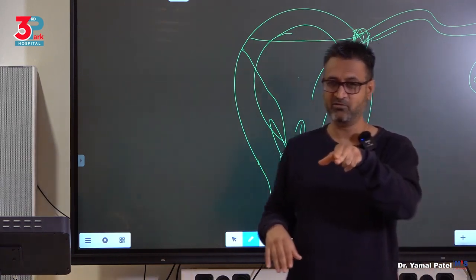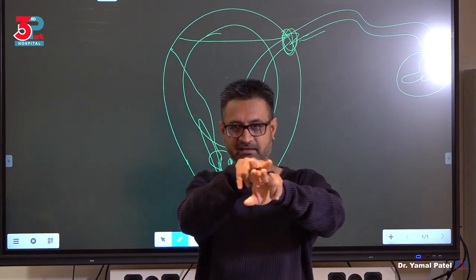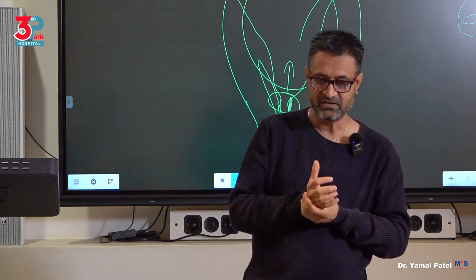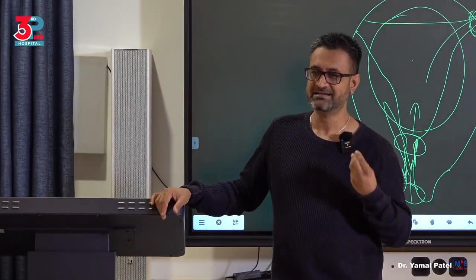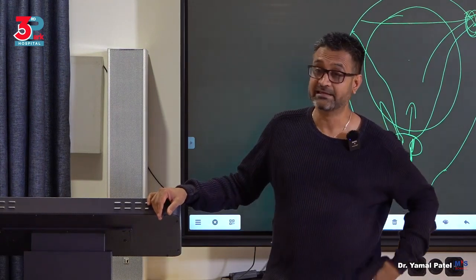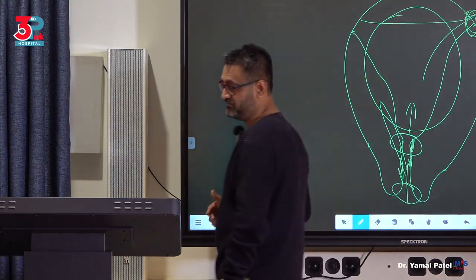I have an instrument that I go in with the scissors, and I would cut what I can see and then proceed. Cut and then proceed. So it's under vision. Number one, risk of perforation is very little. Number two is you can handle those kind of challenges like Asherman's or stenosis of the cervix, or a growth there, or an obstruction there, or an irregular cavity easily by vaginoscopic approach. So you should all be trained in vaginoscopic approach. It should not be direct.